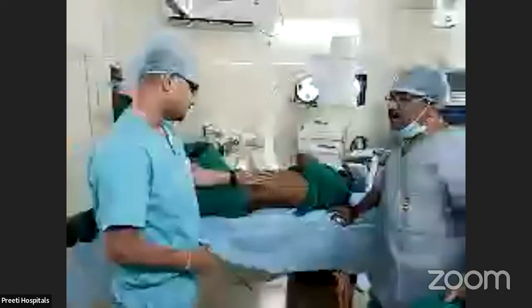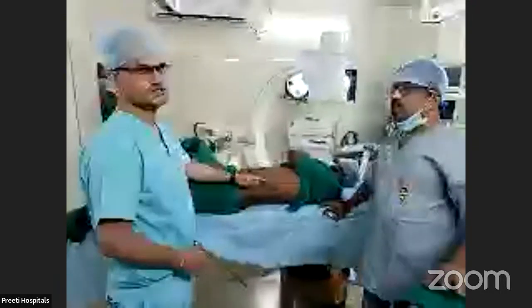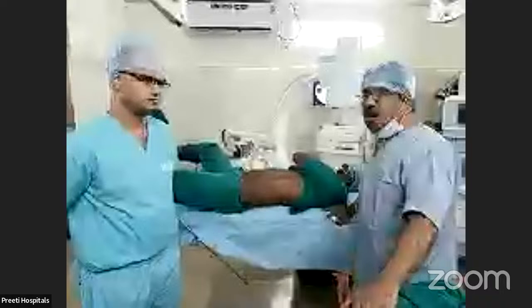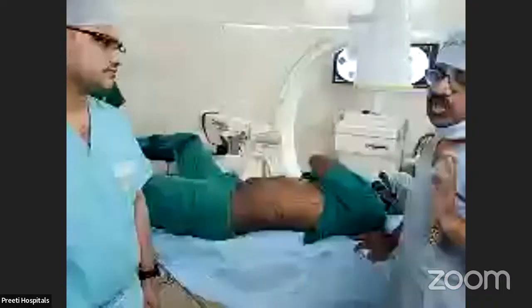Supine, which one is preferred? Middle calyx is preferred in the supine position. So that means if a pelvic stone is present, here you have two options, middle and inferior. Here you will have to go for the middle calyx. That is the most important part.